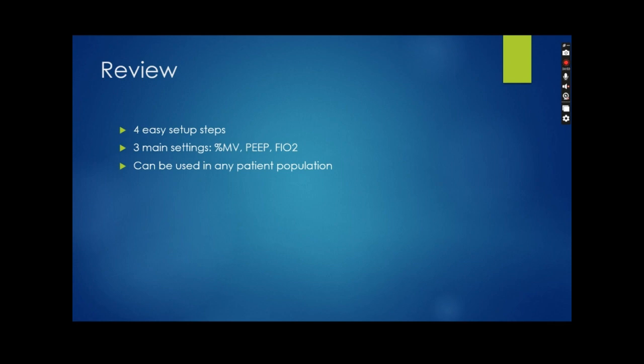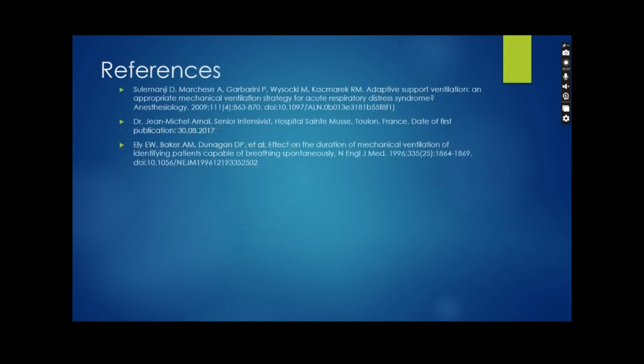It has difficulty maintaining the support for that patient in that moment. So it's not always the best mode in that population, but it can be used in the neuro population. You're really just going to have to pay attention to what your patient is doing and what type of breathing pattern they're presenting.